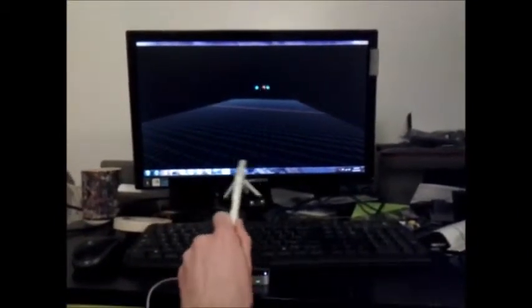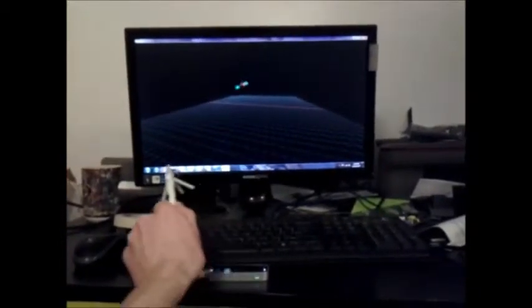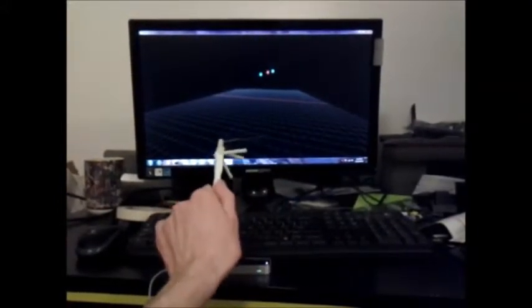One advantage to this method, as well as the next few, is when multiple attachments are used, it is hard for the rod to be mistakenly perceived by the controller as an attachment since angle constraints can be assigned between the rod and the attachments.